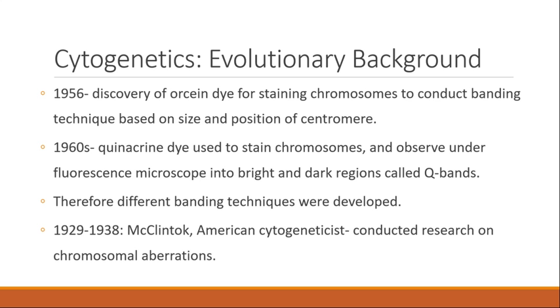Just to give you an introduction to the banding technique, basically it is used so that within one given set of chromosomes we can identify whether there's any structural or numerical change. Again in karyotyping also we observe this: whether there is any structural change in the chromosome, or any increase or reduction of chromosomes in a given set, and altogether we assess whether there's any chromosomal abnormality in the given sample or not.